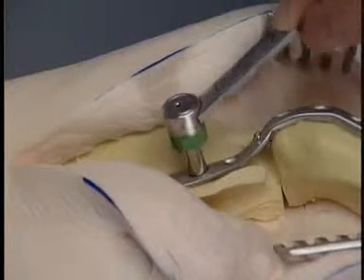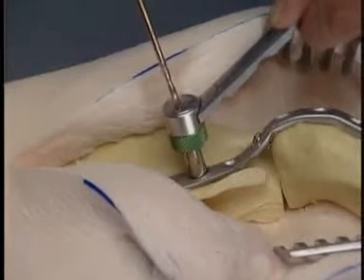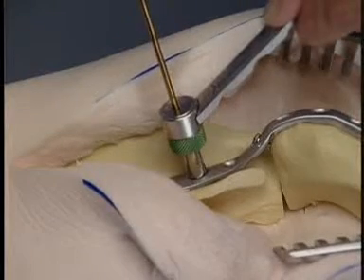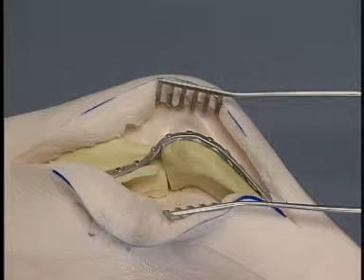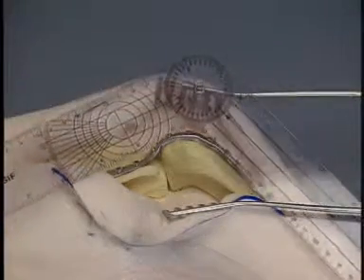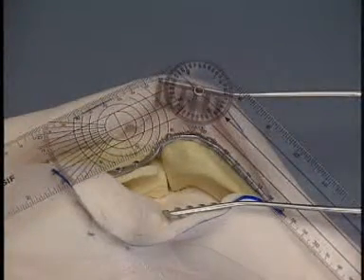The proximal screws are directed into the thick bone at the junction of the spine and body of the scapula. In a clinical case, cancellous bone is collected from the ostectomized humeral head and placed around the arthrodesis site. The angle of the arthrodesis is evaluated critically.